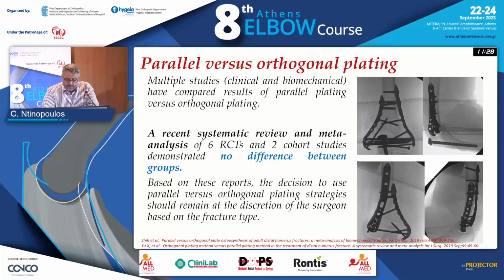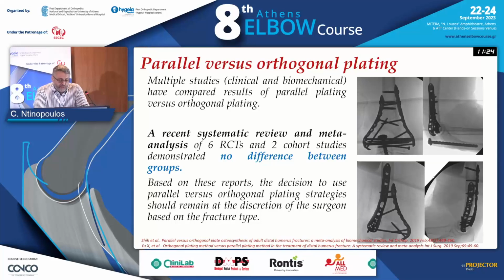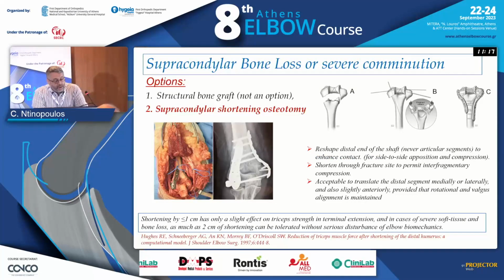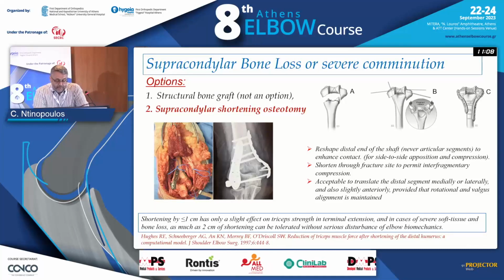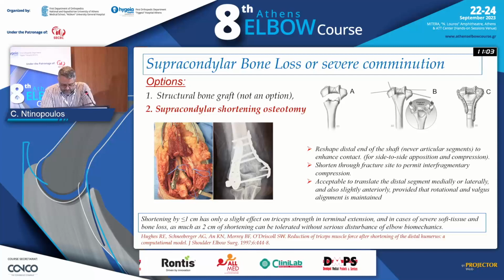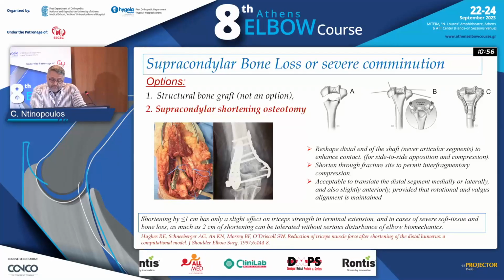There are multiple studies about it, clinical and biomechanical, that prove that there is no difference between the two groups, parallel or orthogonal plating. What's happening now if we have a comminuted area, which is the metaphyseal area, the supracondylar area, and what options do we have? Suggestions from older types of fixation: put a strong structural bone graft. Not an option, actually. Shorten it, yes.